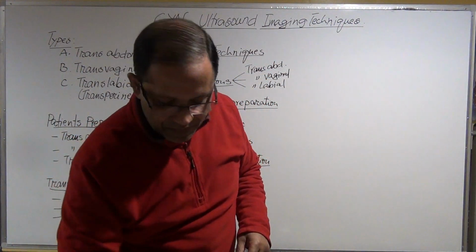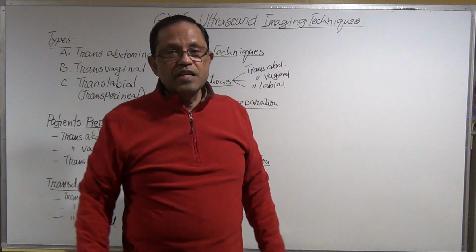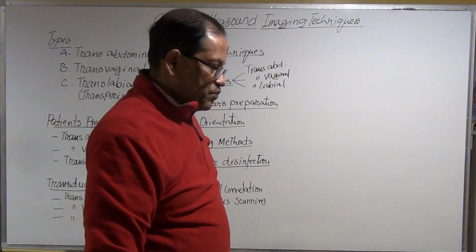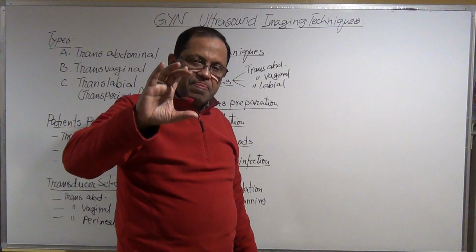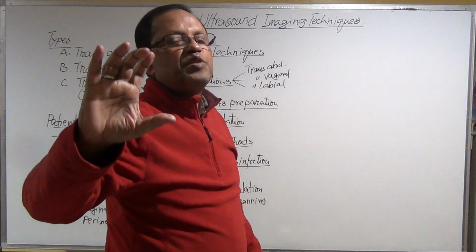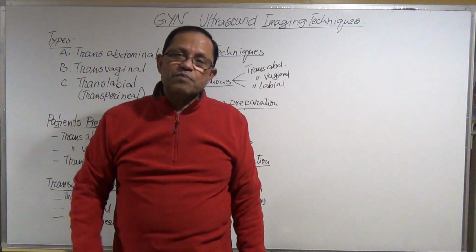So now, what are you going to do? They will say it's your choice, but one thing we can do: they will give you a cup, say an 8 ounce cup, and ask you to just empty 2 of these cups, 16 ounces.